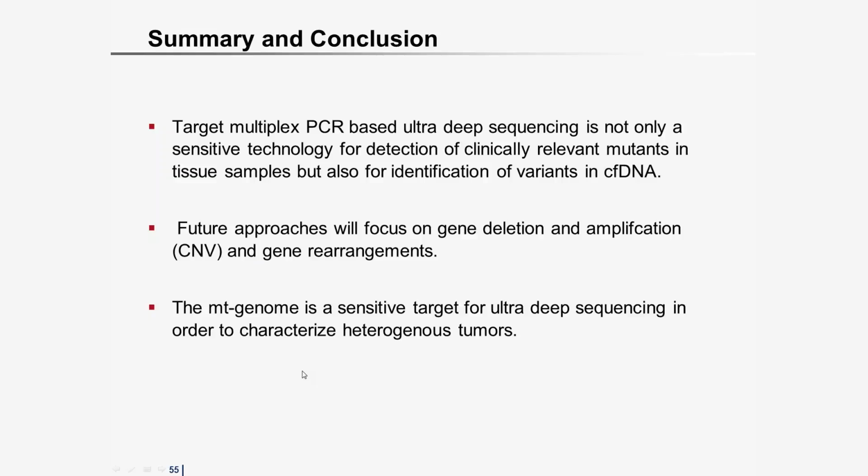We think that the mitochondrial genome is a sensitive target for ultra-deep sequencing in order to characterize heterogeneous tumors, and maybe also gives us some other possibilities to use it in diagnostics. And QIAGEN has now also designed their own mitochondrial genome primer set, so that it's now commercially available.